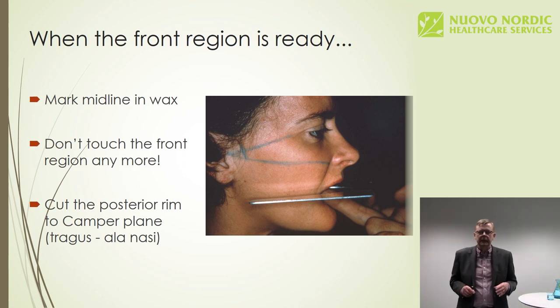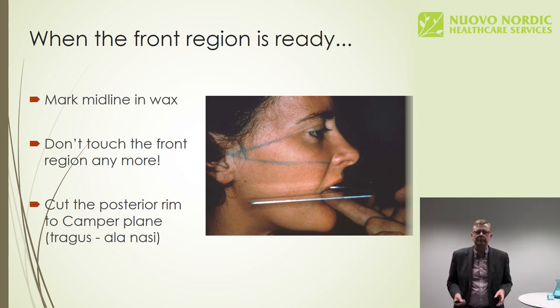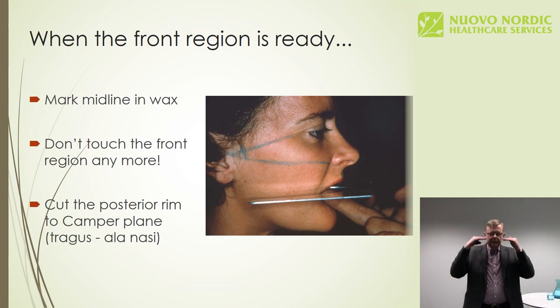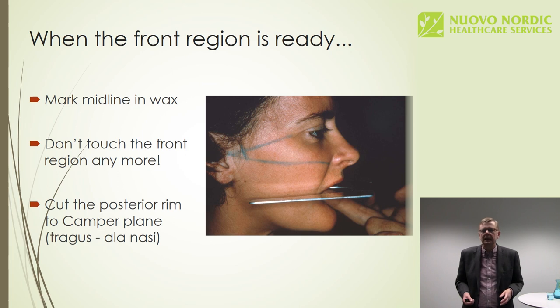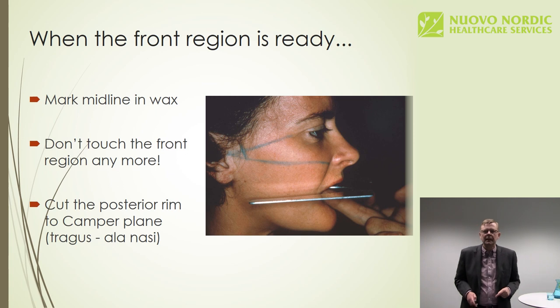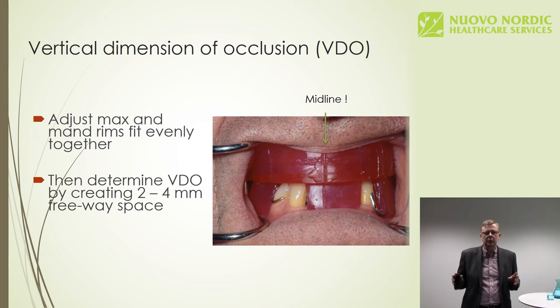We'll move on into adjusting the posterior part of the wax rim. Here we can also use the Fox plane if we wish. The Camper plane is the main reference plane for the occlusal wax rim and the dental arch. We'll just cut the posterior parts of the wax rim parallel with the Camper plane from tragus to ala nasi. And when we are done with that, the upper maxillary wax rim jaw relation is ready.